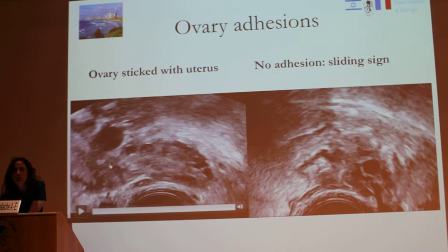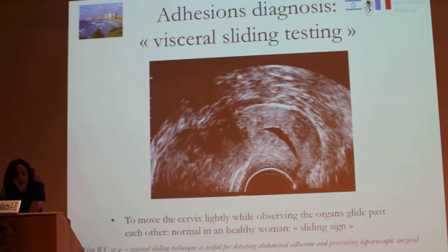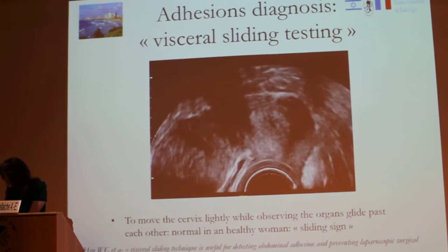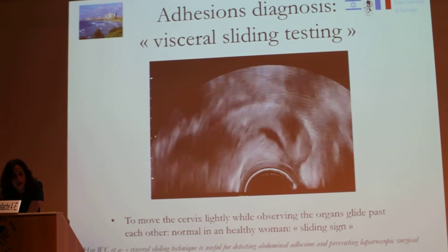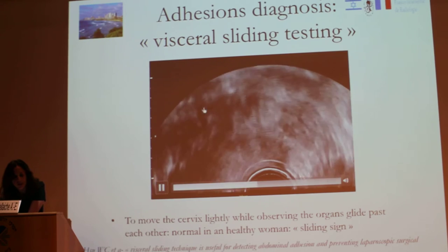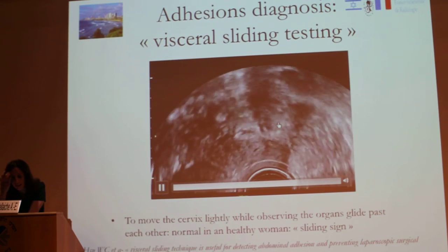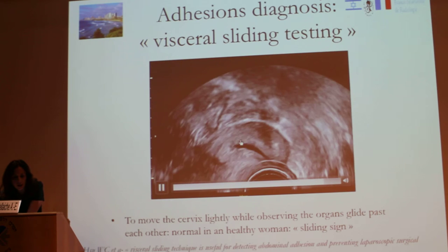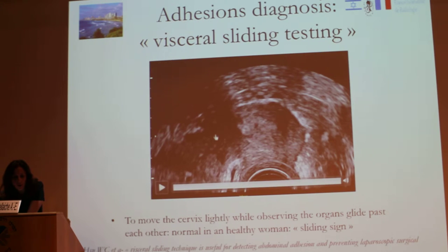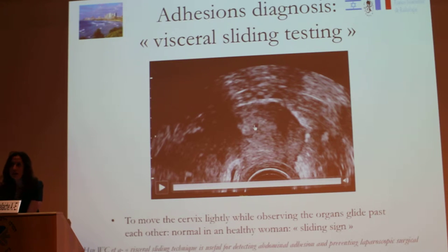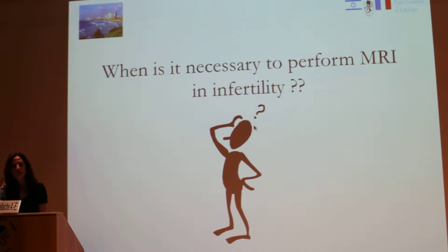It is very important to recognize the presence of adhesions. Here you have the visceral sliding test. You can see that here it is normal — there are no adhesions. The uterus is moving freely and there is separation between the rectal wall and the uterus, so there are no adhesions with the uterus.